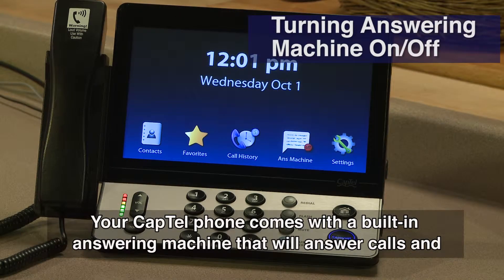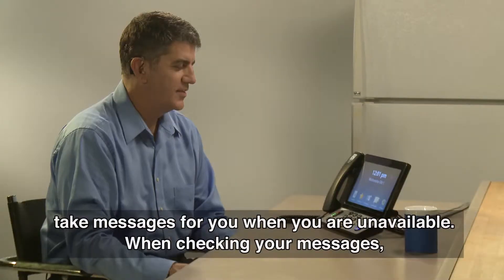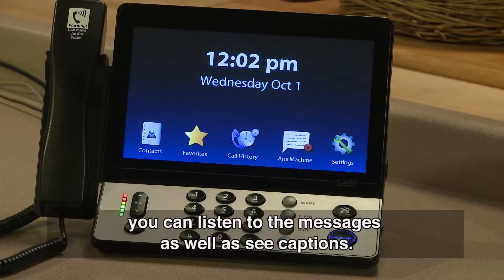Your CAPTEL phone comes with a built-in answering machine that will answer calls and take messages for you when you are unavailable. When checking your messages, you can listen to the messages as well as see captions.